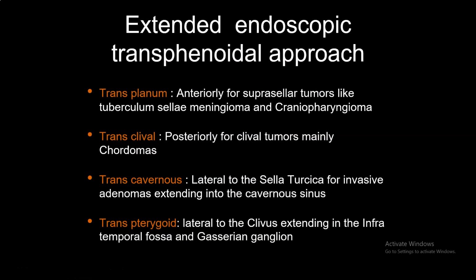The extended endoscopic transsphenoidal approach, we have the transplanum, very easy. We remove the planum to reach the suprasellar region, like what? Tuberculum sellae meningioma and craniopharyngioma. We go transclival. I wanted to say anything outside the sella is an extended approach. If you extend anteriorly, you go through the planum, it is an extended anterior approach. If you extend posteriorly, transclival, you remove chordomas, so it is extended posterior approach.